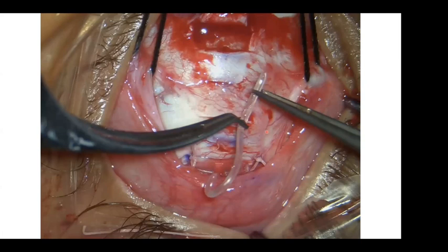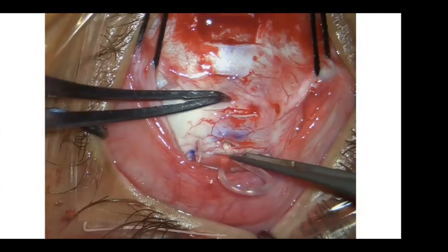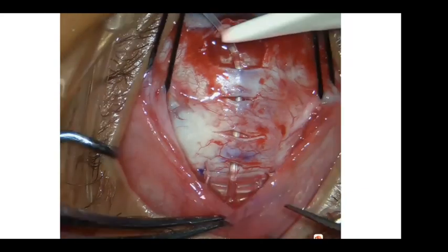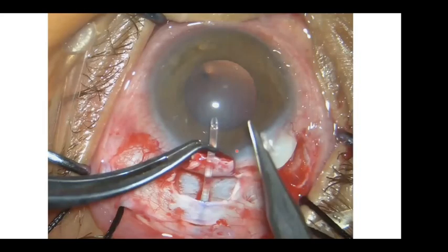Definitely that was not my technique earlier. I used to put the implant and switch. And then after I fix the implant posteriorly, I hold the tube, and then I go through the tunnel, from one tunnel to the second to the third tunnel. So we have three tunnels. It looks like a long tunnel, but I cannot dissect a tunnel that is 9 millimeter with the crescent. That's very dangerous. So I'm just dividing, and those spaces sometimes disappear completely, so it seems like one tunnel, like here.